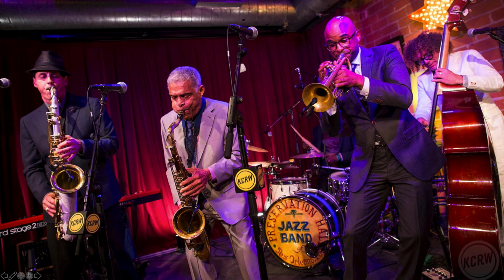So I kind of see this as jazz. Your underlying breath rate that you put in the machine, that's going to be your bass rhythm. That's going to be continuing to go in the background nonstop throughout the song. But then the trumpet player is going to step up and do his own thing. And if he wants to do his own thing and have fun, then he can. But all the while, that bass line is going to be synchronized with him behind.